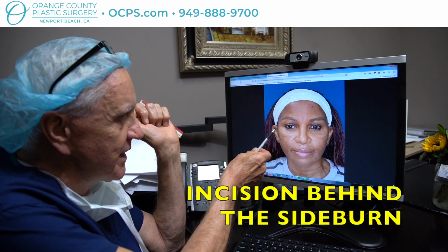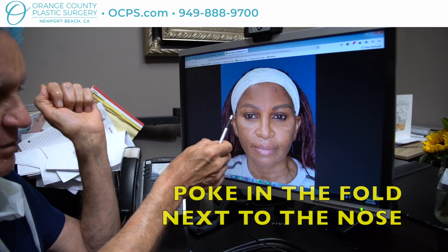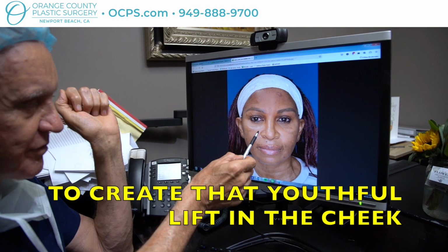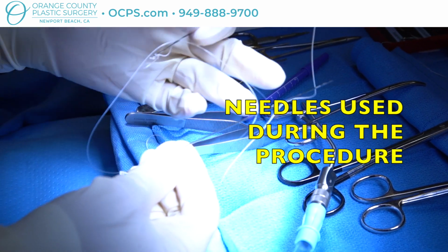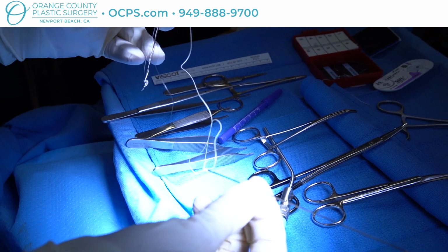We basically make an incision behind the sideburn, make a little poke in the fold, and pass some sutures back and forth to suture this back up to this and restore that youthful round cheek. You can see we've loaded two Keith needles, and these are about 15 centimeters long each. And between them, we have two sutures.